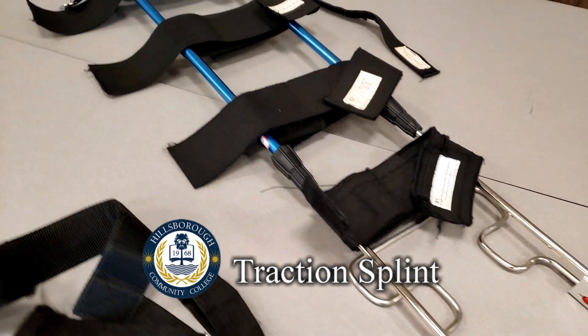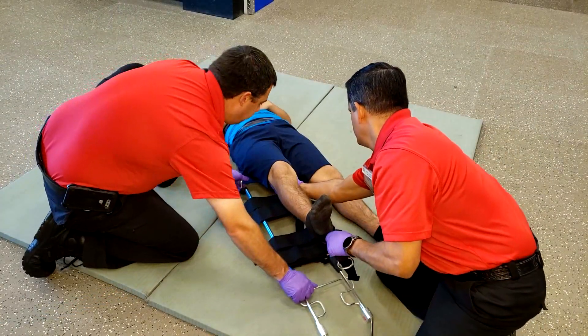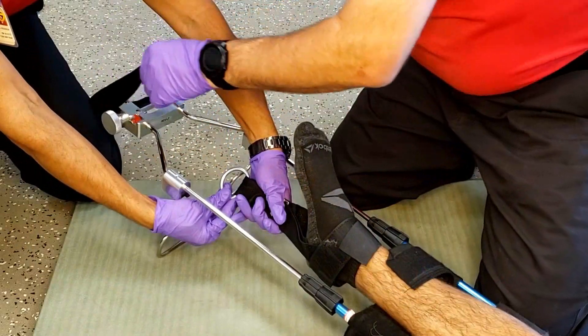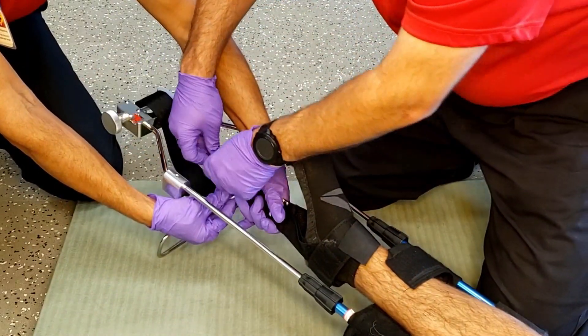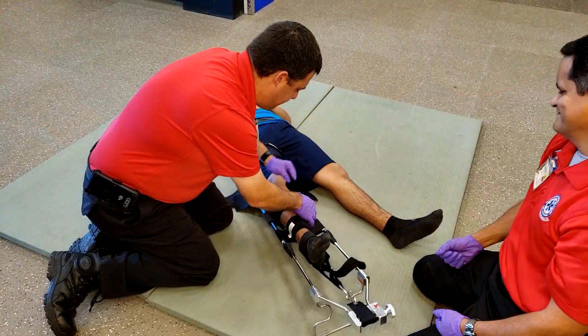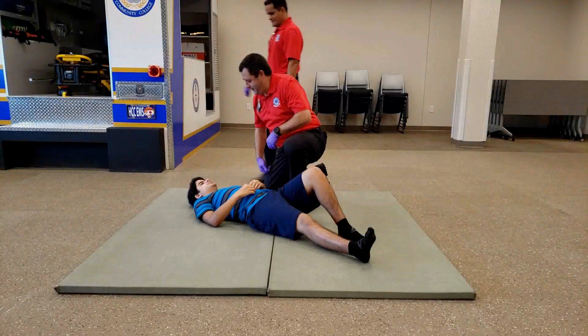A traction splint is a splinting device that uses straps attaching over the pelvis or hip as an anchor, metal rods to mimic normal bone stability and the length of the limb, and a mechanical device to apply traction — used in an attempt to reduce pain, realign the limb, and minimize vascular and neurological complications.